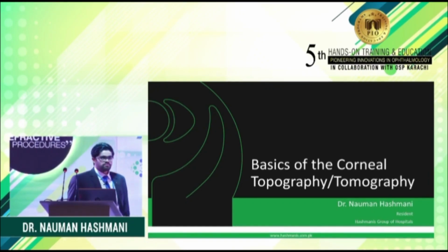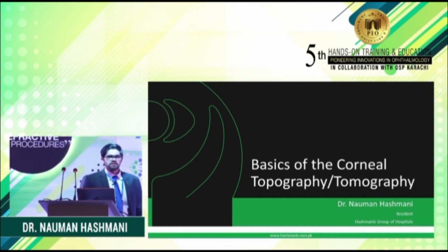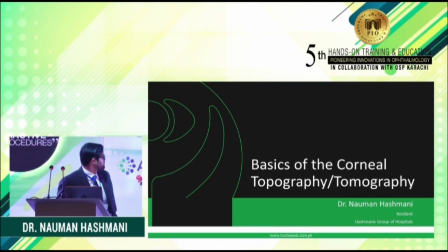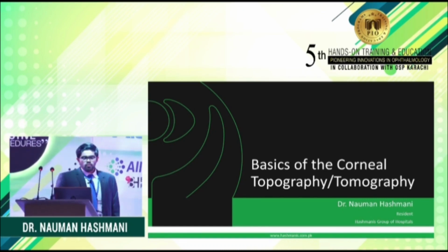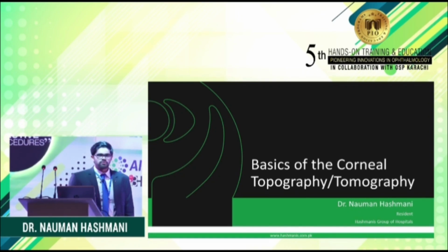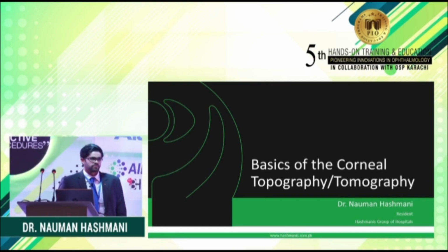I've been spending the last couple of months on this very topic, understanding the nuts and bolts and ins and outs of corneal topography and tomography. What I've been trying to achieve with the talk today is to get people away from a quantitative analysis of the cornea and towards a more qualitative assessment of the corneal topography.